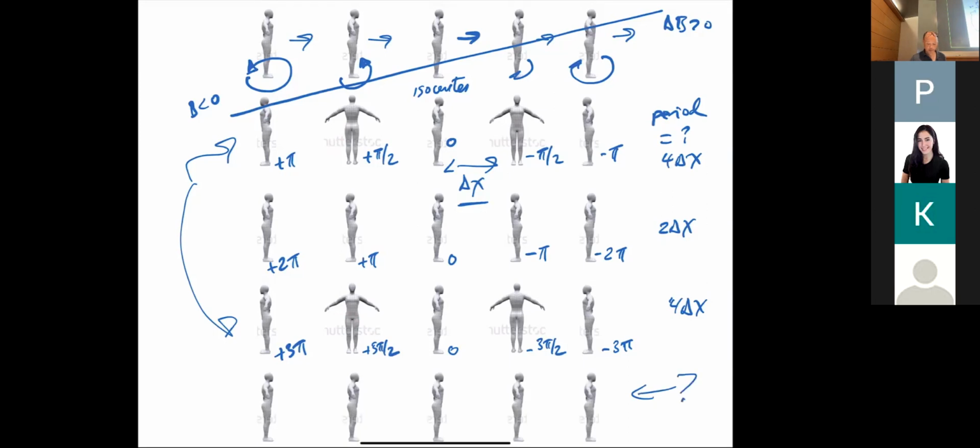And then at this point here, we're back at the period equaling. Oh, so here's the question. What's the period here? Delta x, right? We would call this period delta x, but in the limit, the period would be, so for example, this has a frequency of 1/4 delta x, okay? So that's a spatial frequency. Here, there's no variation. So we actually call this kx equals 0, okay? So basically, there's no variation, so actually, the period, you can imagine, is infinite. So in this discrete example, you could say, well, it looks like it's delta x, but if you imagined these being infinitely close together, then there would be no variation at all. So that's what we mean. So basically, kx, our spatial frequency, is always 1 over the spatial period of repetition, okay?